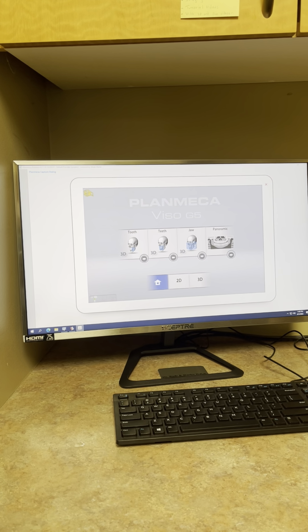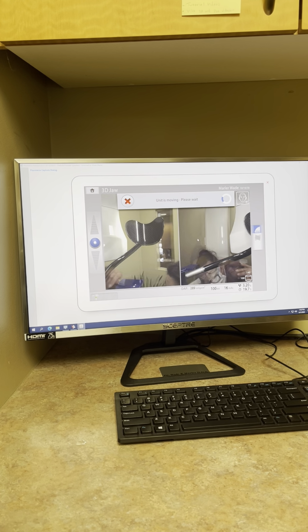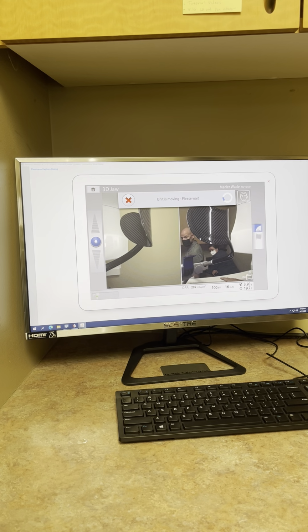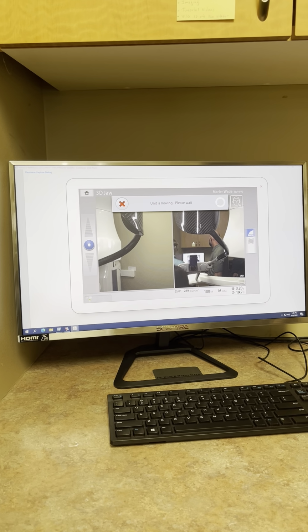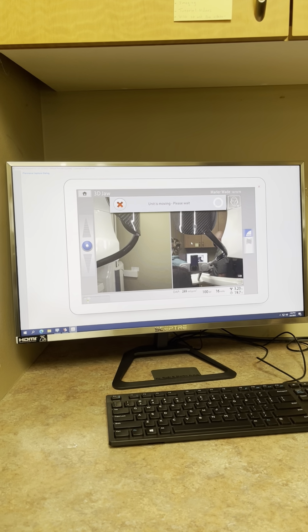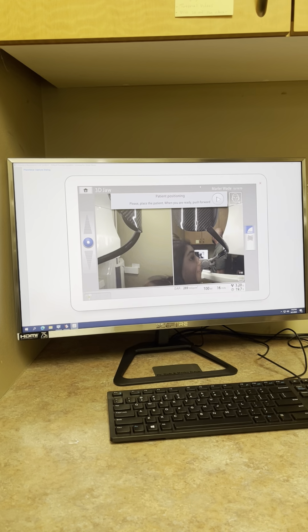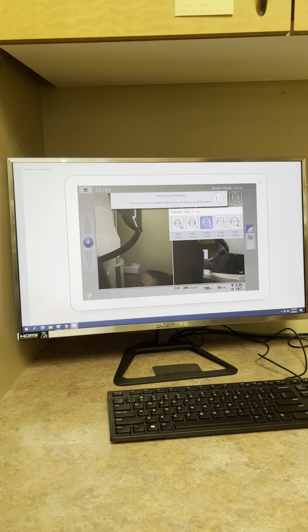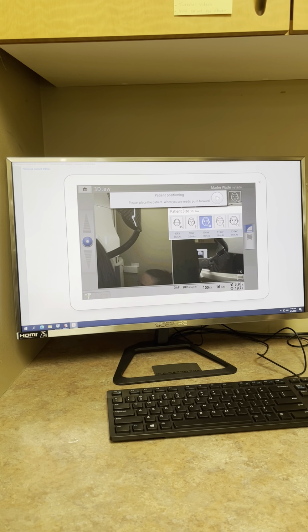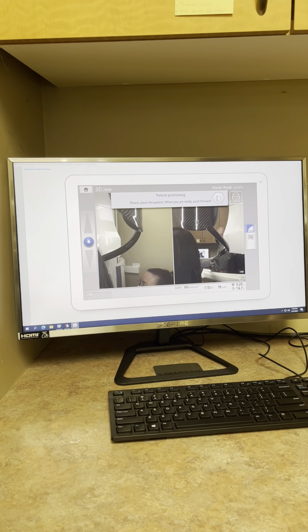If you're taking the full jaw, watch your head. Is it moving? Not yet. Still moving. All right. So you have the patient's name at the top, so we know we've got the right patient. You want to select the correct patient size, which is clicking this, so pediatrics through extra large patient. And then you want to select your resolution.